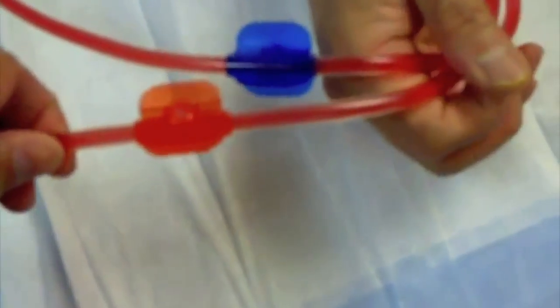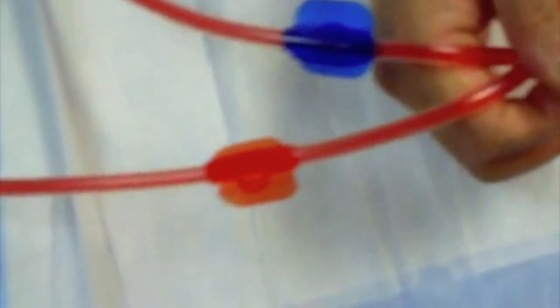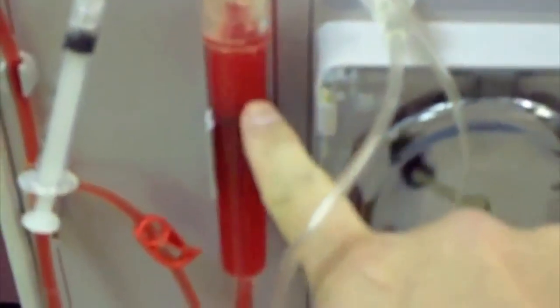Now let's track the path of the blood that's coming out of the patient, going to the dialyzer. The red line goes to the arterial chamber, which secures any bubbles so that they won't be introduced into the dialyzer.